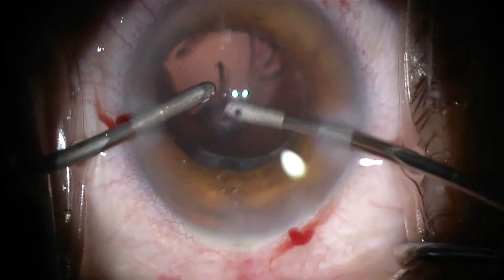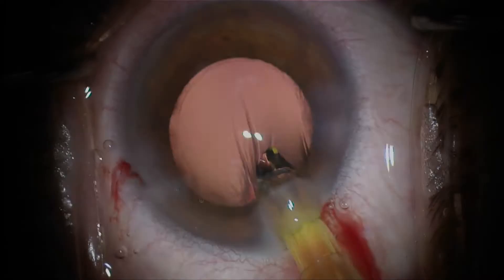And we can now insert the intraocular lens. In this case, this is an acrylic lens. It looks slightly yellow because it has a blue filter.